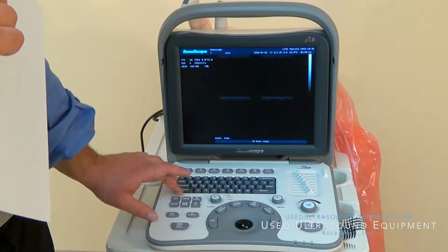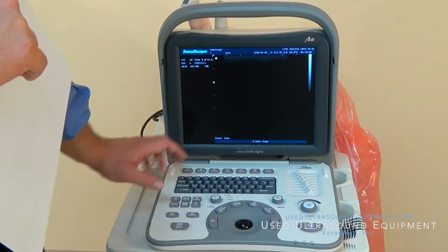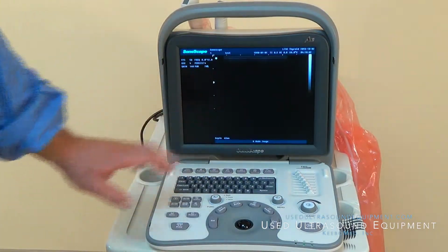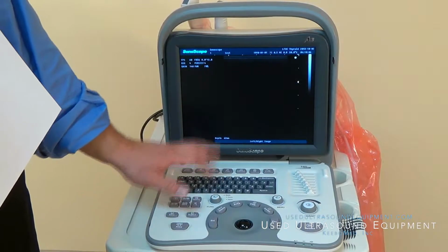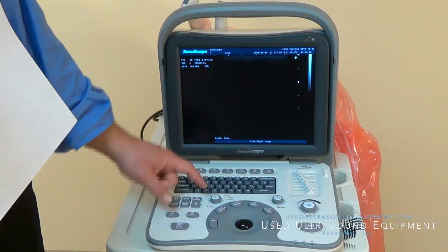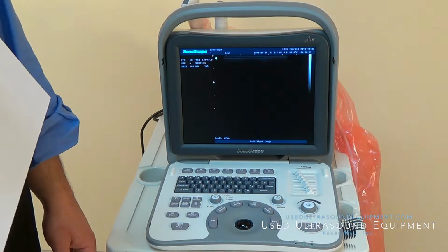Depending on the type of positioning you're in, or if you're in a tricky spot, sometimes you have to put the machine or operate in a way where you might want to flip the orientation, whether that be upside down or left to right. That's a user preference. Most people usually don't touch those, but it is available if you need it.